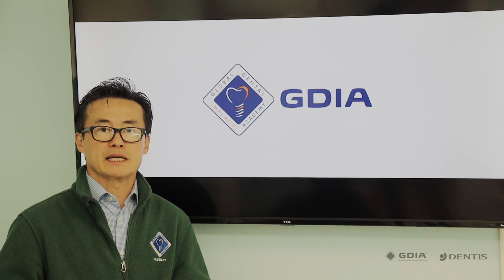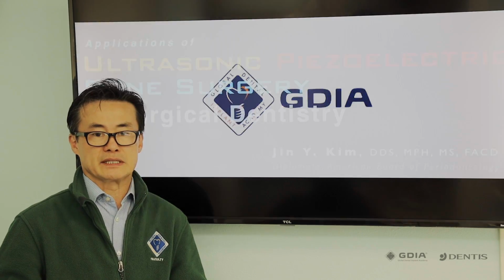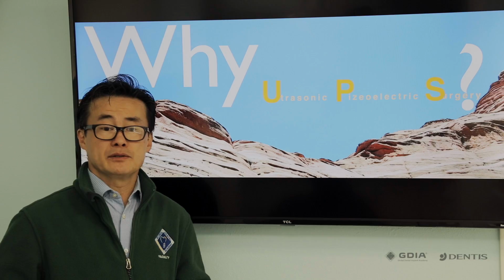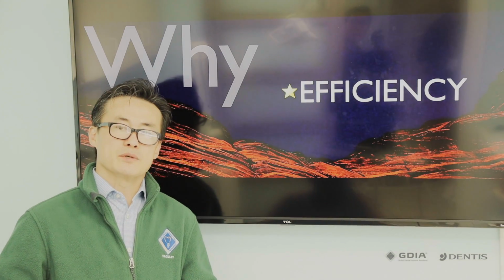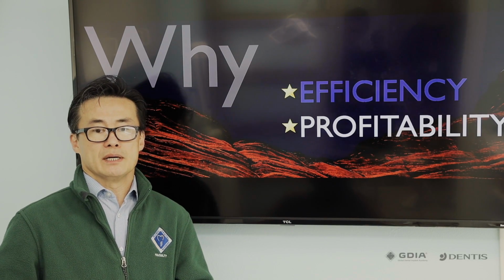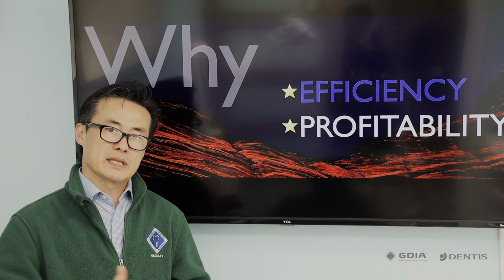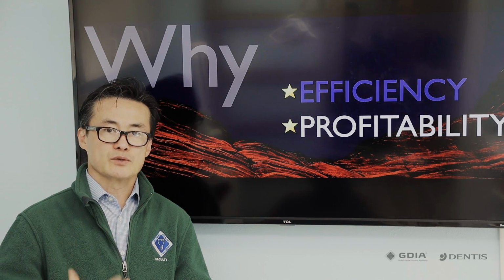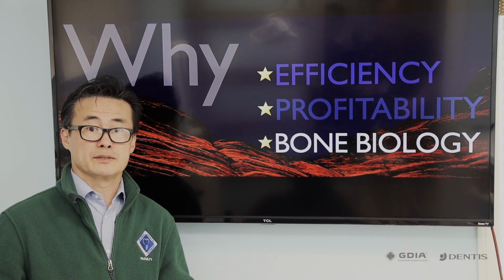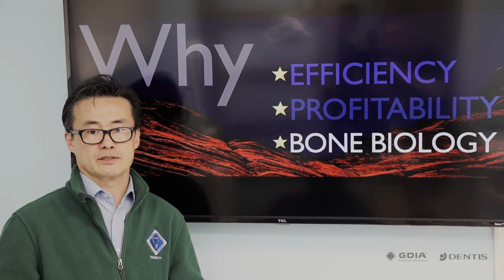In this series, I would like to show you some tips about why we use piezoelectric surgery device. So, ultrasonic piezoelectric surgery device, why do we have to use it? Well, mainly we want to find the most efficient way to handle bone. Therefore, in a private practice, profitability relates directly to how efficient and quickly you can get things done. But at the end of the day, we want the bone biology for the patient to be at the optimal, for the maximum amount of comfort and healing, and so on.